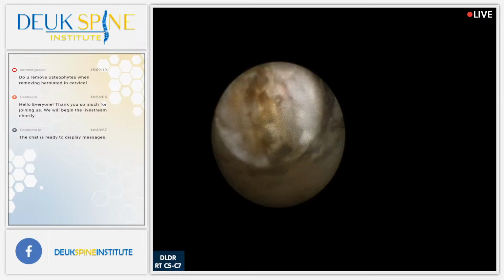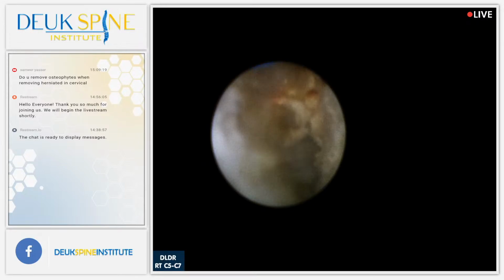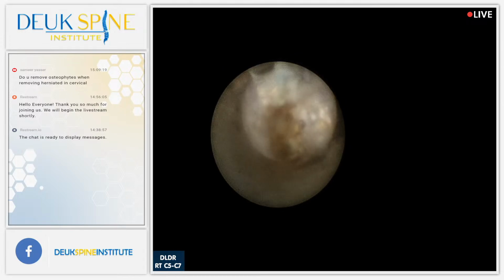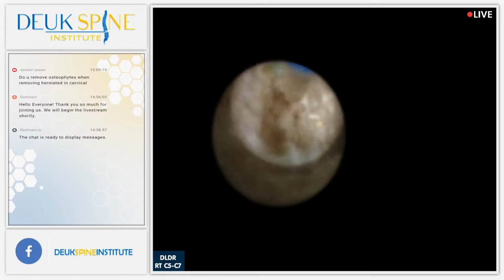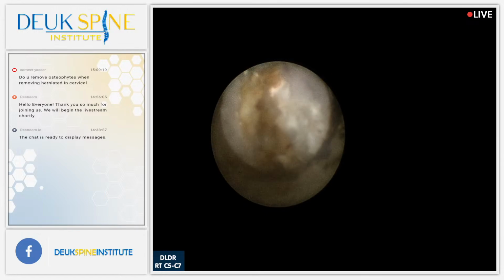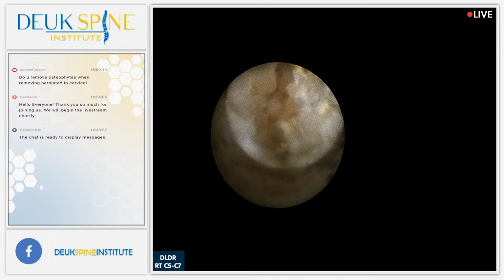This is one of the worst cases I've ever seen. As a matter of fact, but I still think we're going to be able to help him with this surgery. This is herniation right here. It's just, see how scarred it is and how it's turning gold in color? That means that it's got lots of calcium in it.